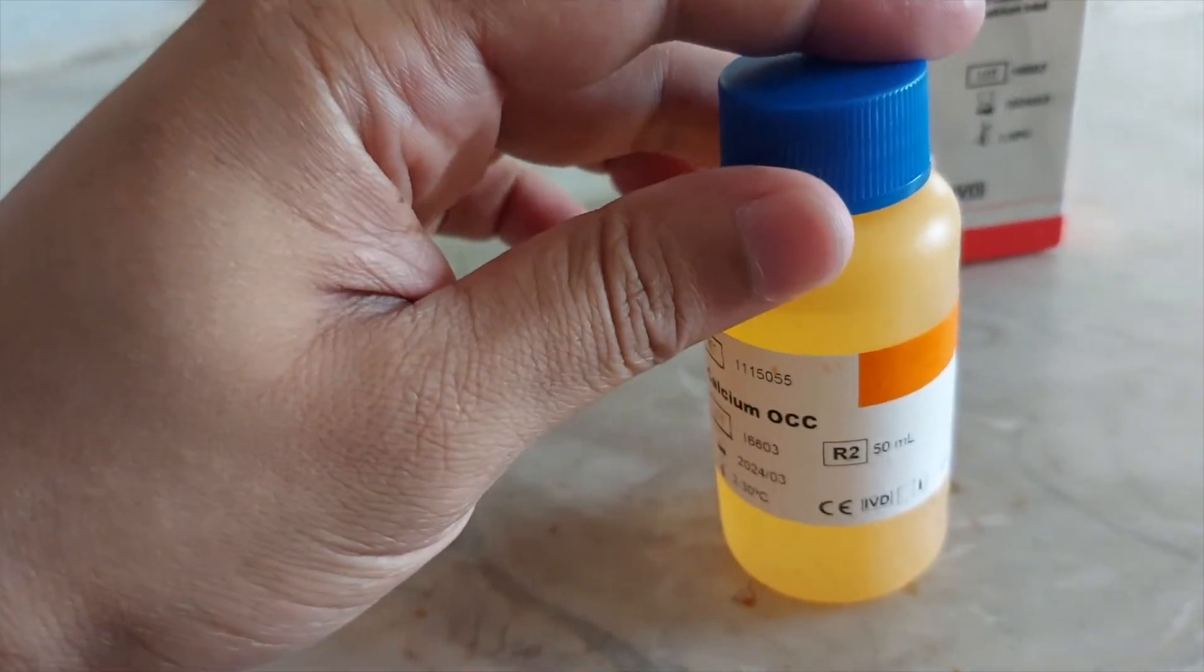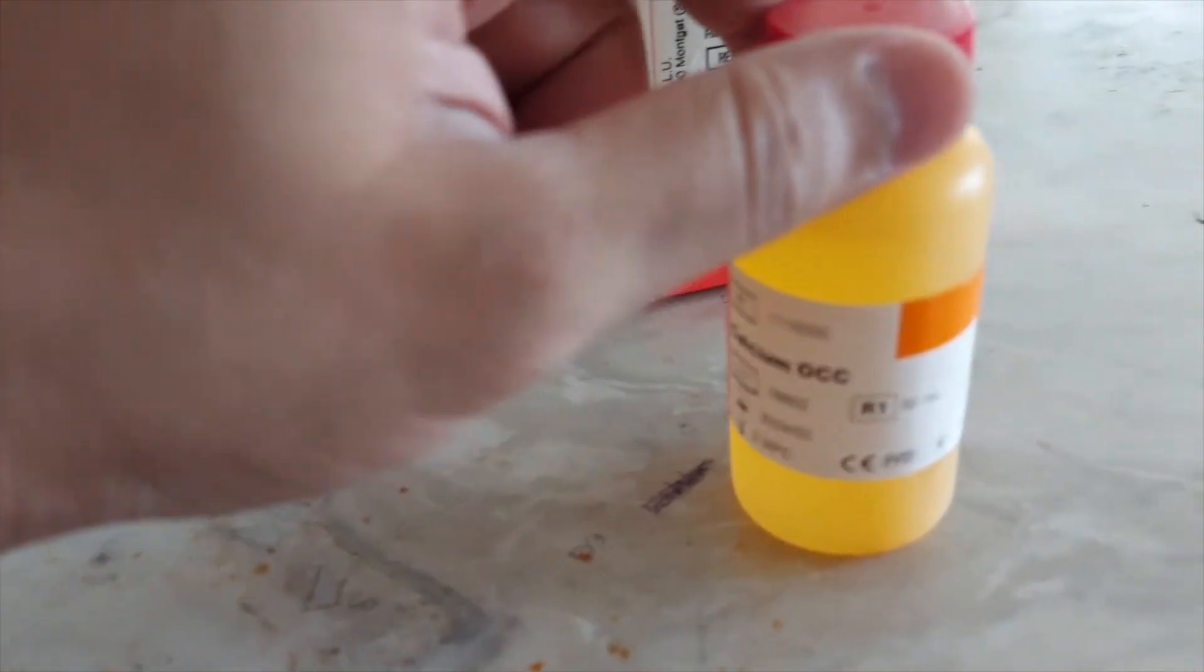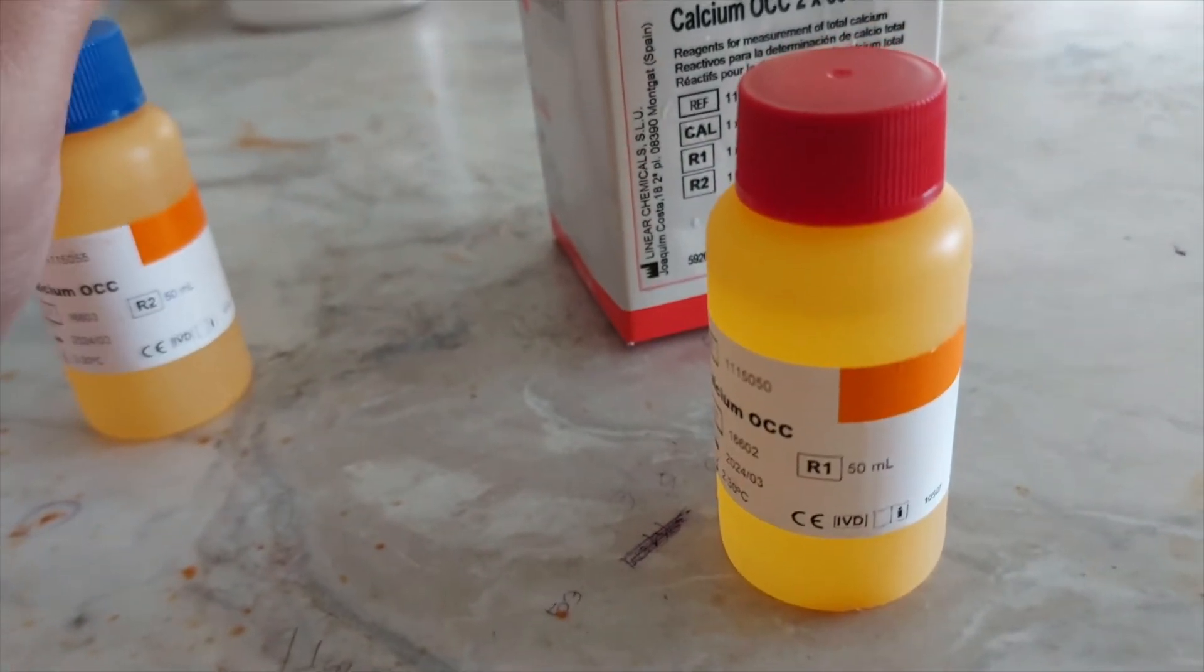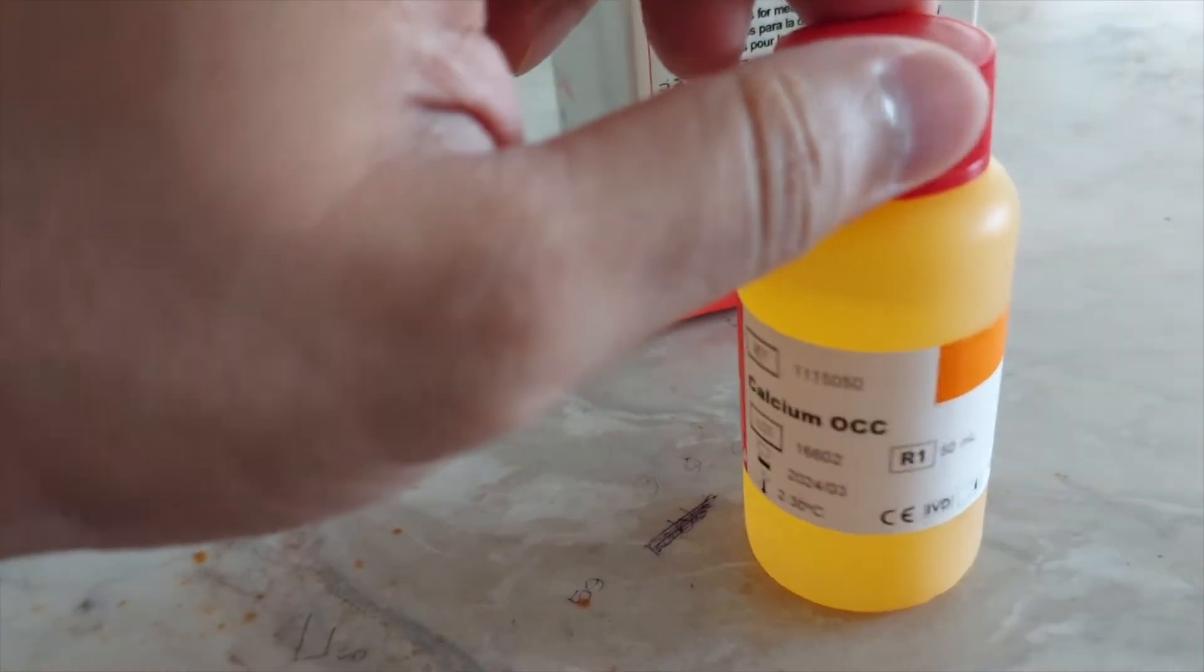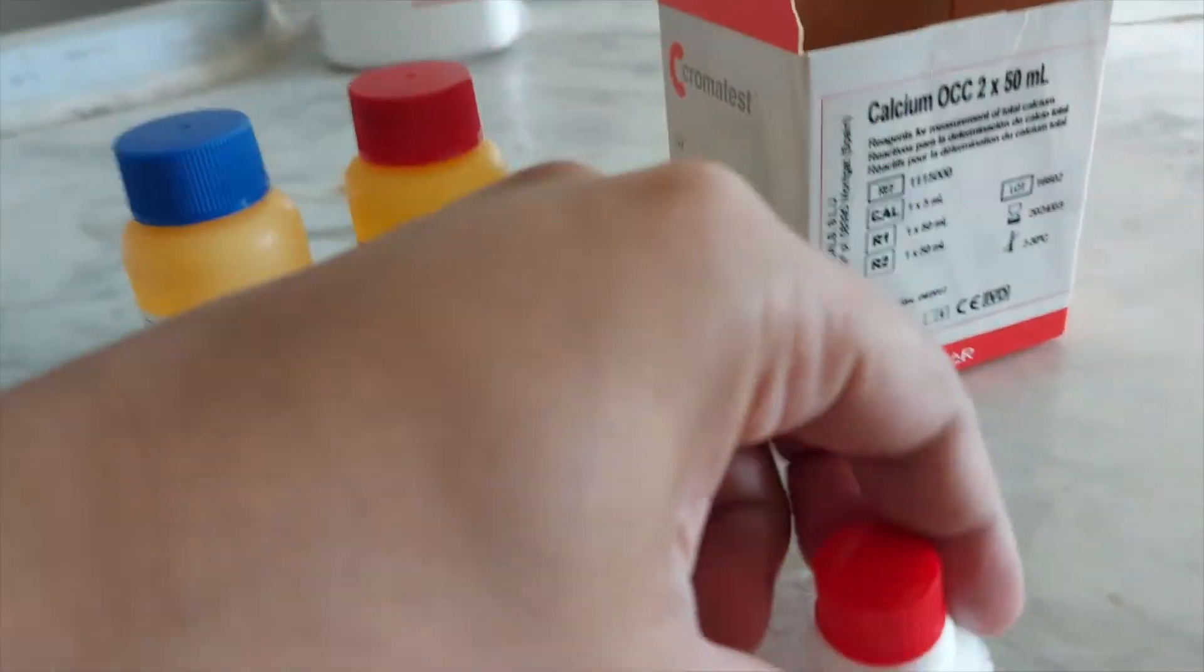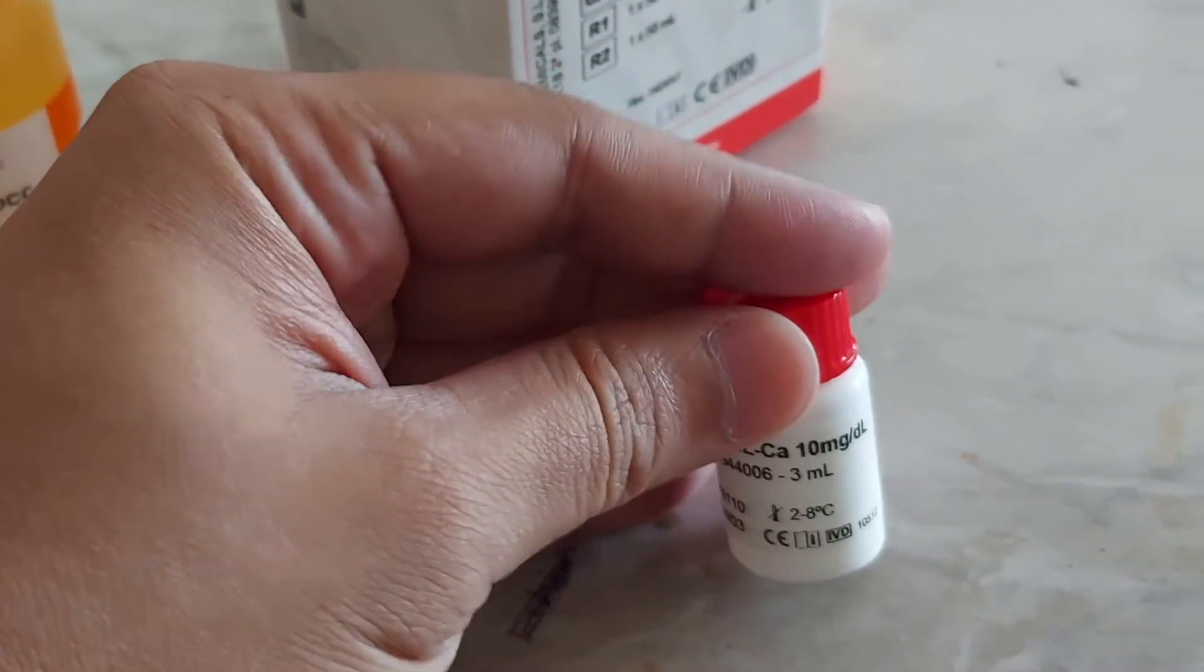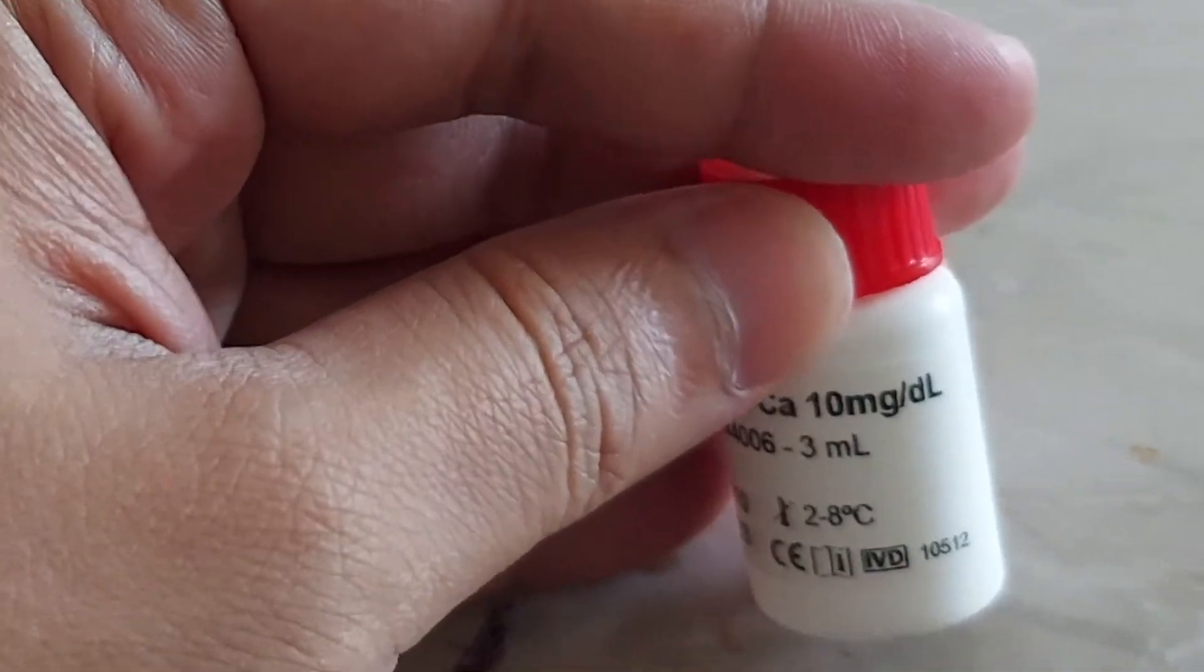Here is our reagent number two, named as R2, which is actually a buffer. And here is our reagent number one, which is cresolphthalein complexone. And the third chemical we have is the calcium standard. You can see the concentration of the calcium standard is 10 milligrams per deciliter.